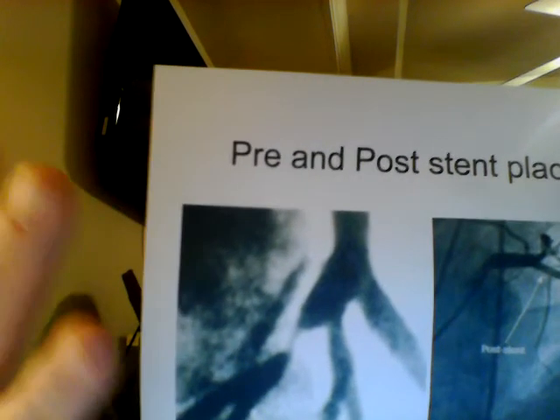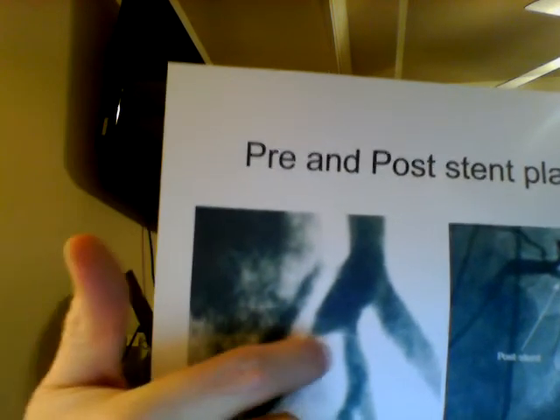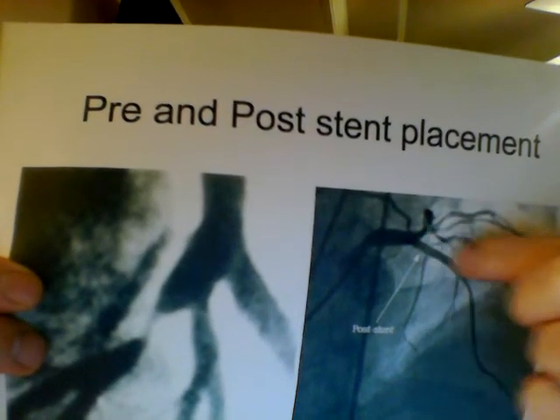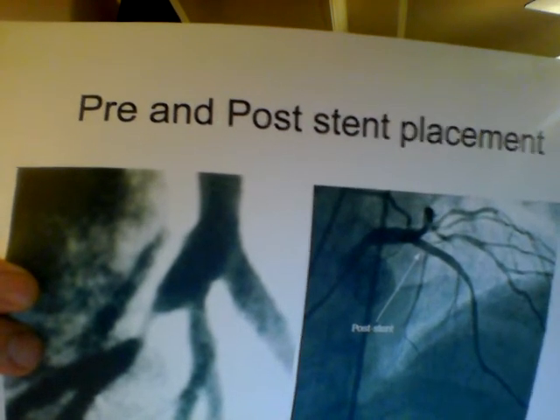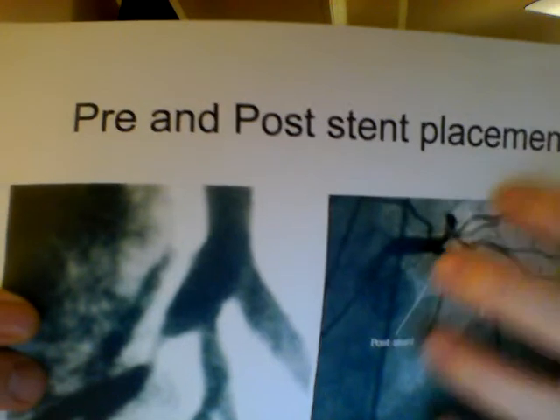So you hear about 70%, 80%, 90% obstruction. This would pretty much be a 90% obstruction, or maybe even more than that. But they'll take this part and they'll insert the drug-eluting stent. And the drug-eluting stent, you can see, has been placed right here. And you can see how wonderful of a job that does, allowing the blood to flow back as it's intended to. And it feeds all of this heart muscle. And when that heart muscle gets the blood, then it will continue beating and living and being healthy.